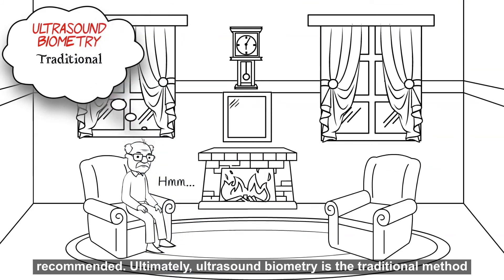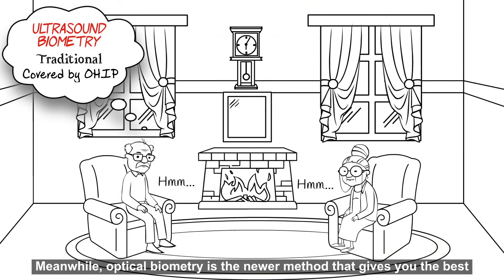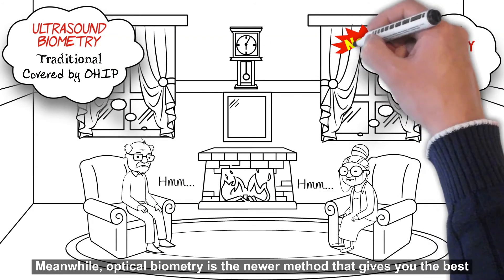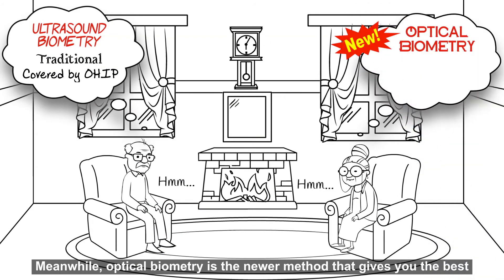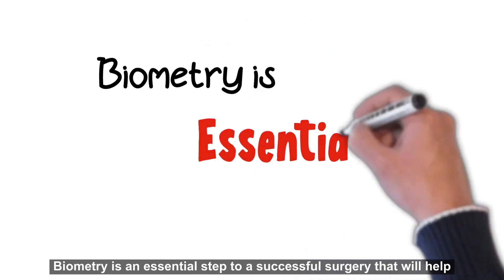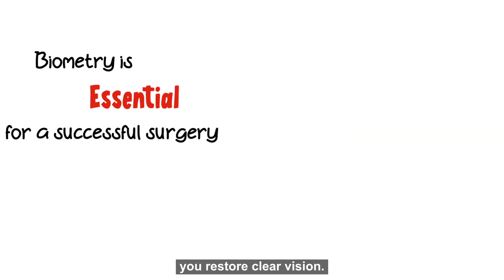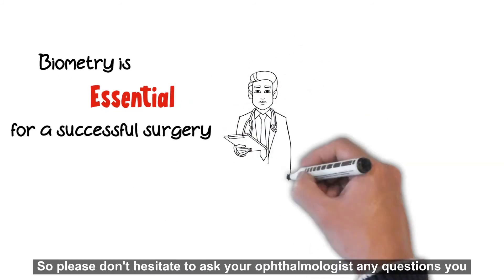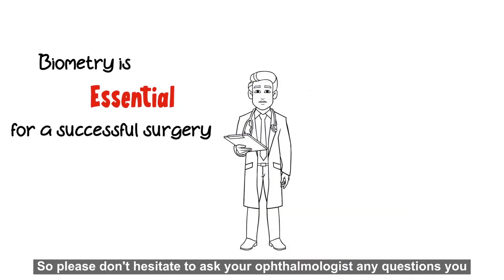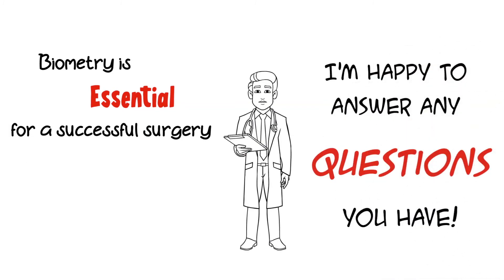If you've had previous refractive surgery, optical biometry is highly recommended. To summarize: ultrasound biometry is the traditional method covered by OHIP, while optical biometry is the newer method that gives you the best possible accuracy but is not covered by OHIP. Biometry is an essential step to a successful surgery that will help you restore clear vision, so please don't hesitate to ask your ophthalmologist any questions you may have about the procedure.